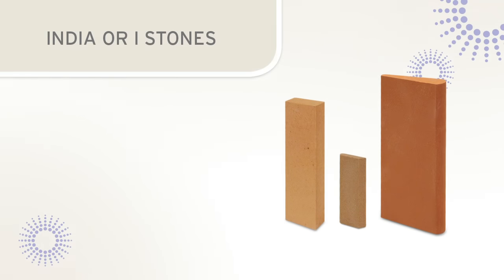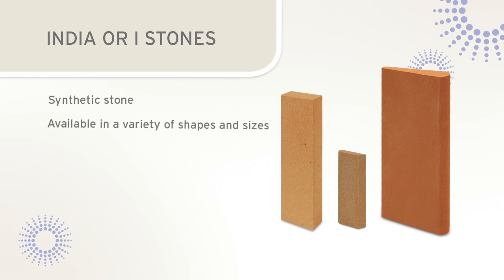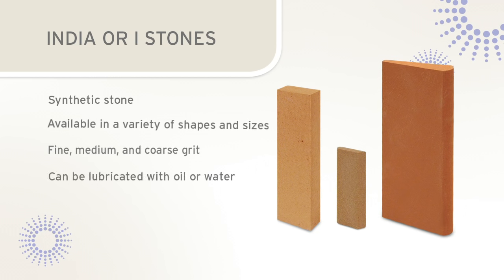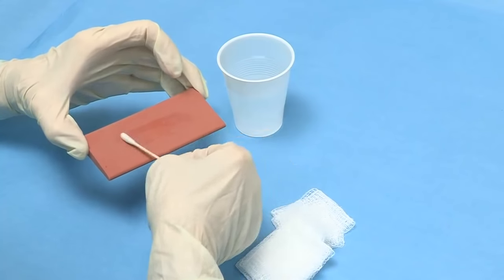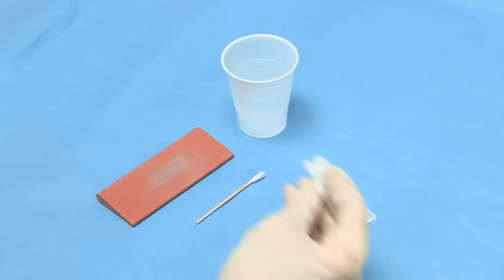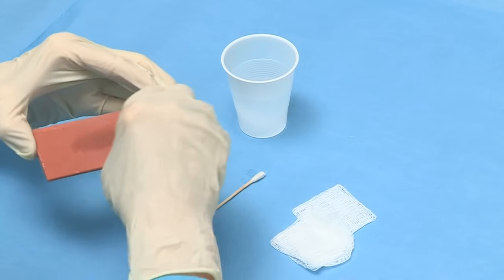India stones, sometimes called eye stones, are synthetic or man-made stones available in a variety of shapes and sizes. India stones are available in fine, medium, and coarse grits, and are often used to recondition worn instruments. Water or oil can be used to lubricate an India stone prior to sharpening. Since the India stone is man-made, it does not build up sludge like the Arkansas stone; instead, there will be a collection of metal filings that can be wiped away with gauze.